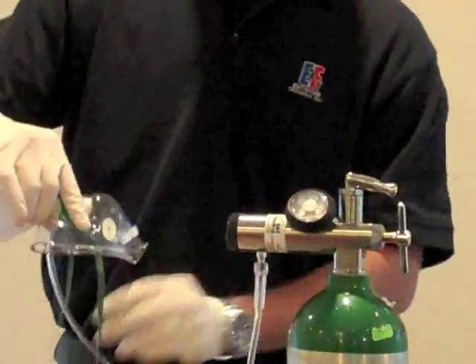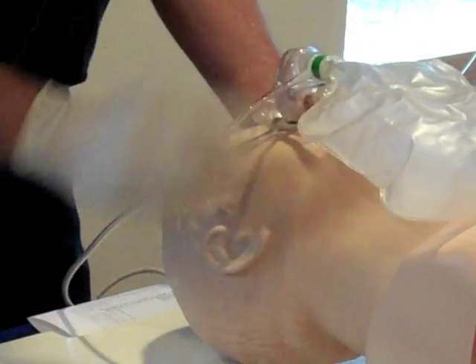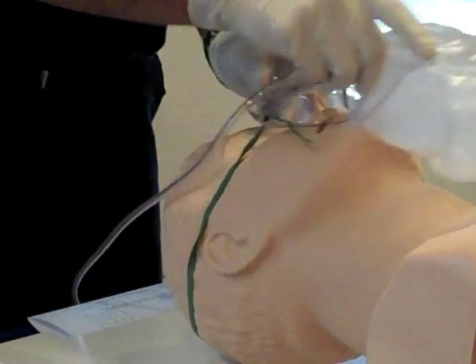Apply the mask to the patient's face. In order to keep the mask in place, adjust the elastic straps and the nose bridge clamp if necessary.